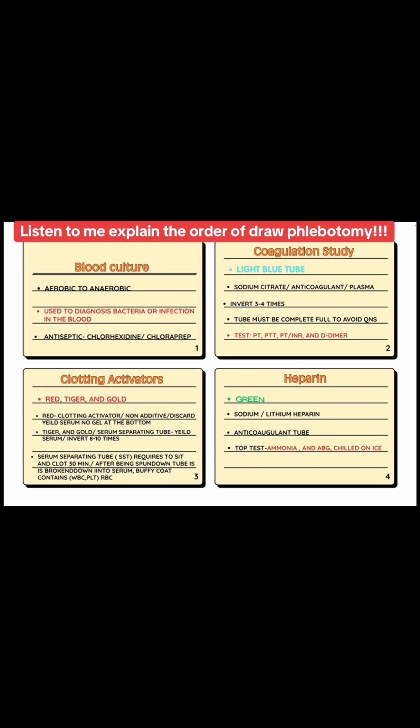So the way that you will transfer the serum to another pour-off tube is by pipetting the serum. Be careful because you may have a little bit of red blood cells going on there, depending on how you pipette the serum out of that tube and transfer it into a pour-off tube. With an SST tube, because that gel barrier is there, there is no need to worry about the serum mixing with the red blood cells.